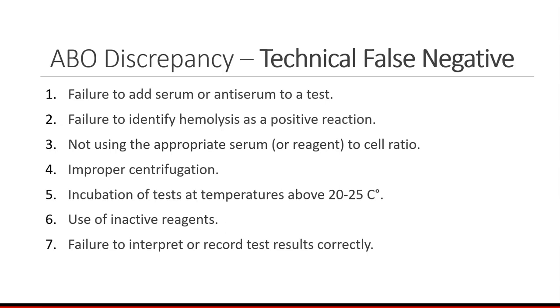Incubations of tests at temperatures above 20 to 25 degrees centigrade, which is room temperature, which is in the 70s, 72 to 74, I believe. If you didn't record the temperature when you first started in the morning, and it turns out your laboratory is 85 degrees Fahrenheit, you're going to get false negatives. So again, this is a CAP requirement, CLIA requirement. You have to record your temperatures every day. So follow the manufacturer's instructions and make sure the temperature is within the ranges permitted.